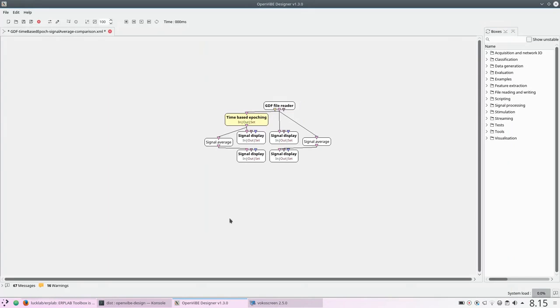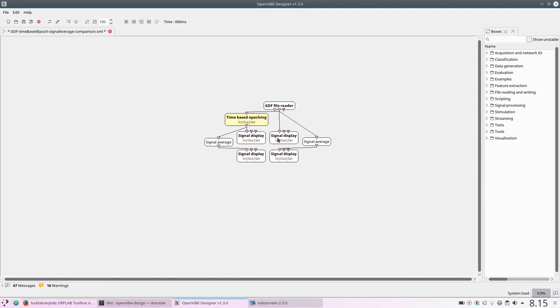I've got a basic OpenVibe scenario here, importing some sample data in GDF format. And I send that data directly to a display so that we'll be able to compare with these other boxes here.